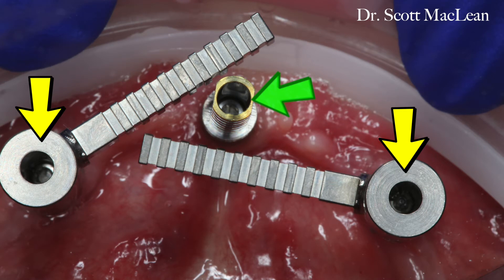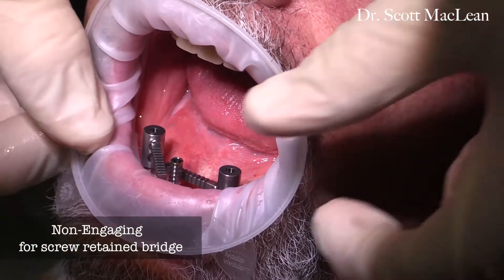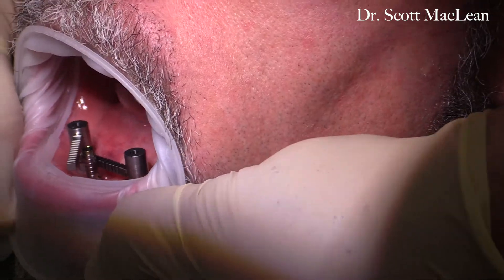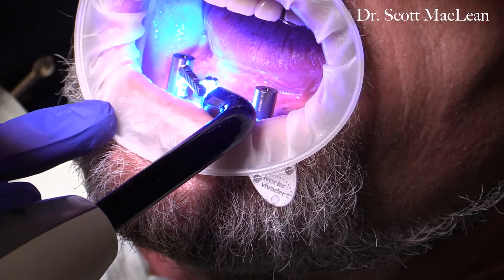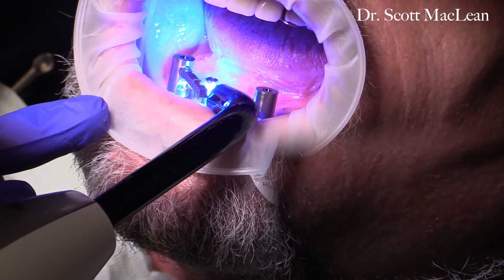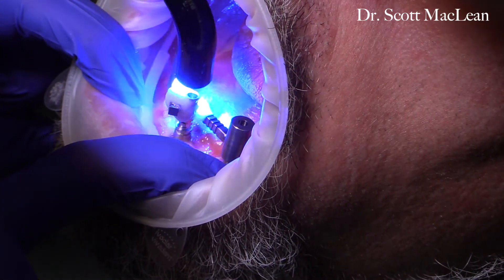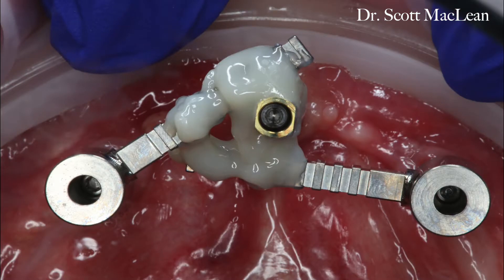These are quite rigid, which is good for when you're placing resin, but you do have to leave a space for the resin to come around that center abutment and around the arms of the transfer abutments. All three of these abutments are non-engaging, which is important when doing bridge work — you need to sit on top of the platform and not inside. We'll start placing the resin around the cylinder in little increments so that we don't have any shrinkage, working back and forth across different areas to make sure everything is secure.